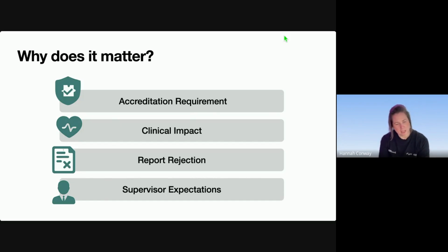And the other thing to consider with TOE is we're putting the patient through a higher risk. With transthoracic, we can pop a probe on with the confidence that we're not putting the patient under any form of risk, really. Certainly not from a mechanical risk, but we are now doing that through the method of actually inserting a probe into the esophagus. So you really want to make sure that if you're taking that risk, the benefit at the end of it outweighs that.